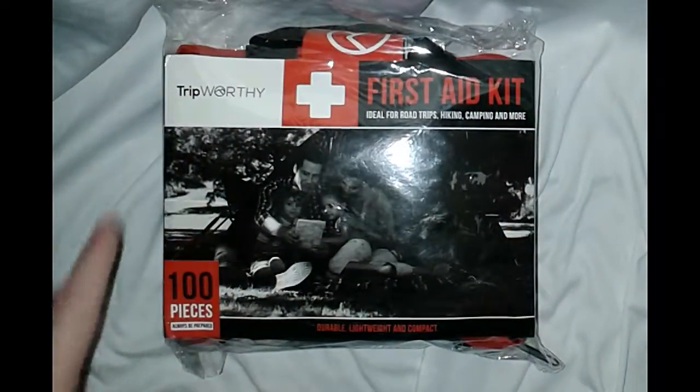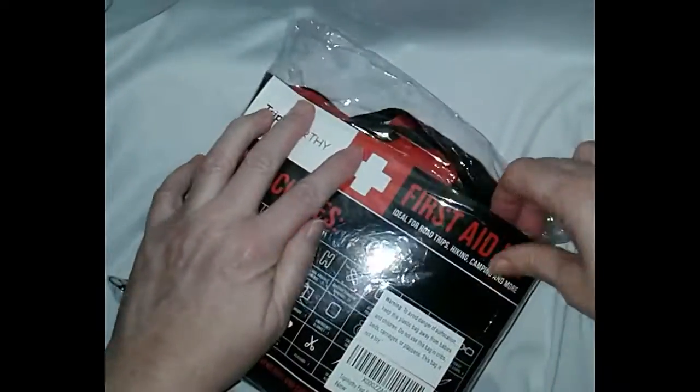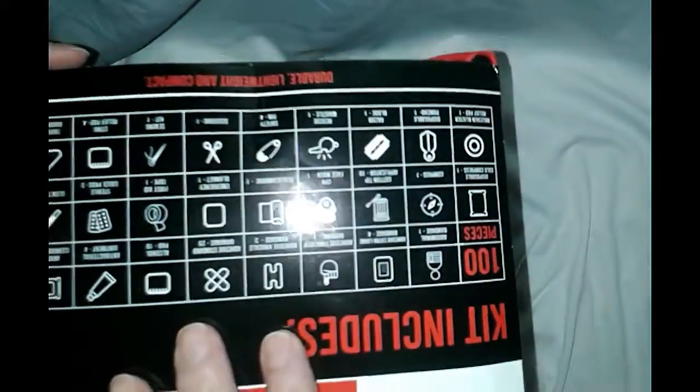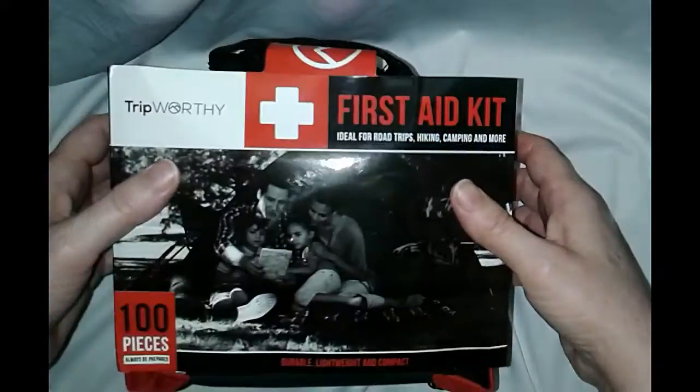It's smaller than those big ones that are just filled with empty space. It has a hundred pieces in it. My last first aid kit was made out of hard plastic — it fell and cracked, so I had to toss it. I like how this smaller size will fit in your car between the seats, in your glove compartment, or stowed away in the tire well.